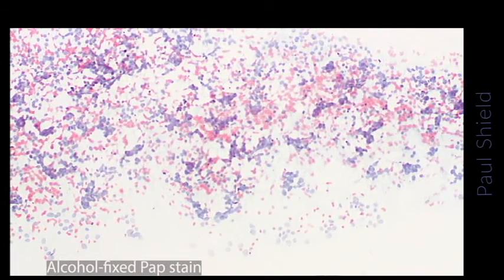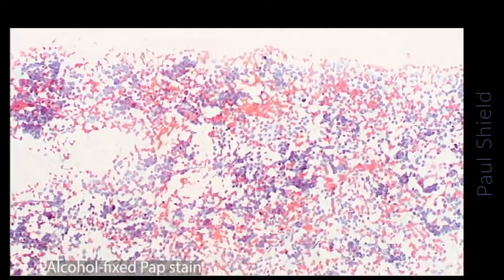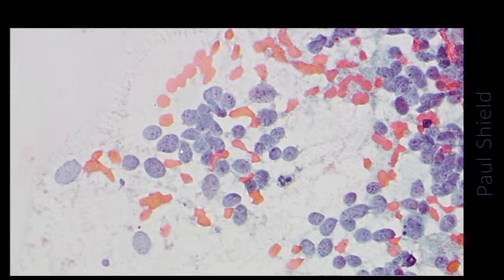And this is the alcohol fix slide. Features, so dispersed nuclei and then very tight groups of wrapped up nuclei. There's a bit of crush artifact here as well. High power, interesting chromatin. It's kind of quite fine, but then it has little dots inside it, so we would call that stippled chromatin. Some of them are round, some of them are a little more elongate, and they are in places wrapping around each other a bit.